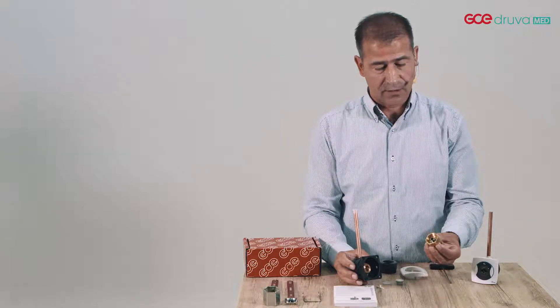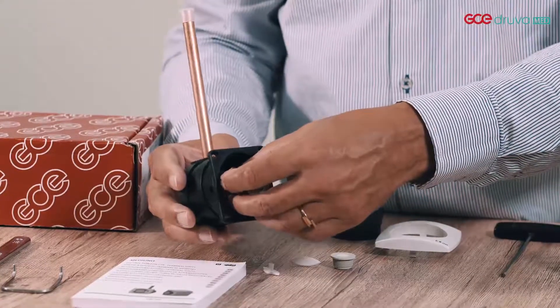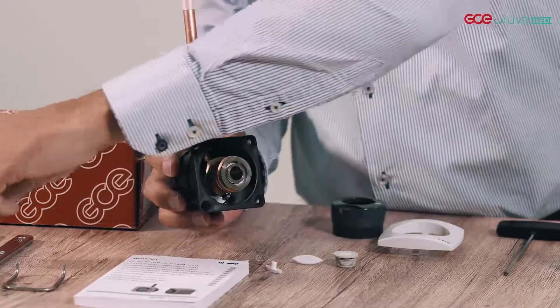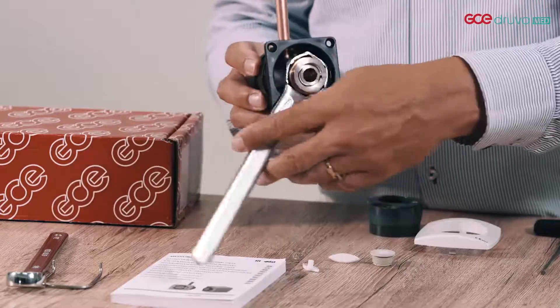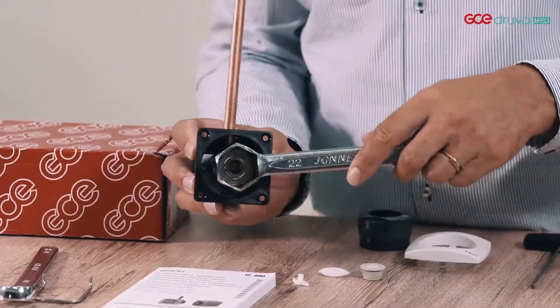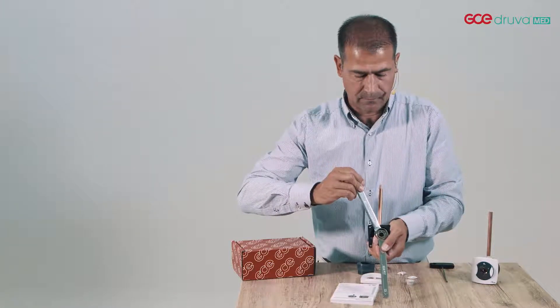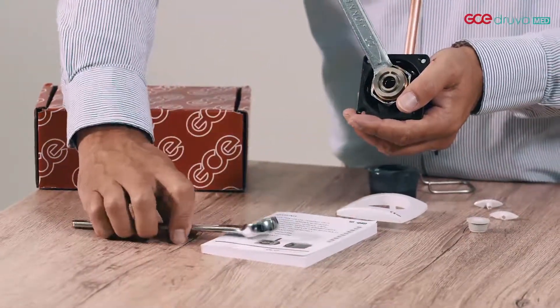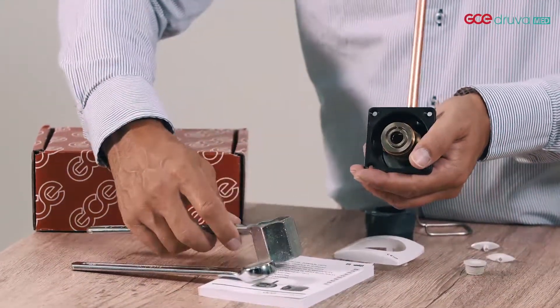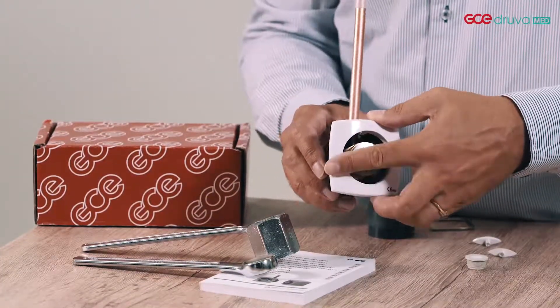Now I will show you the assembly of the second fix or gas specific quick connector.